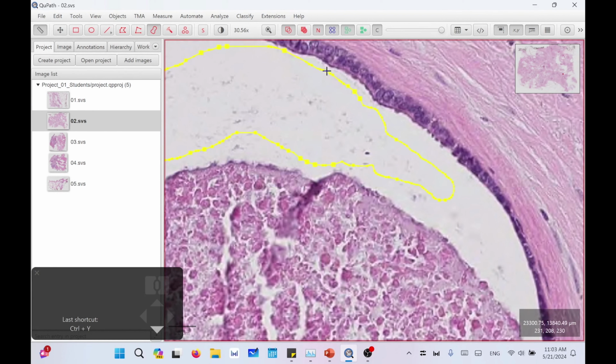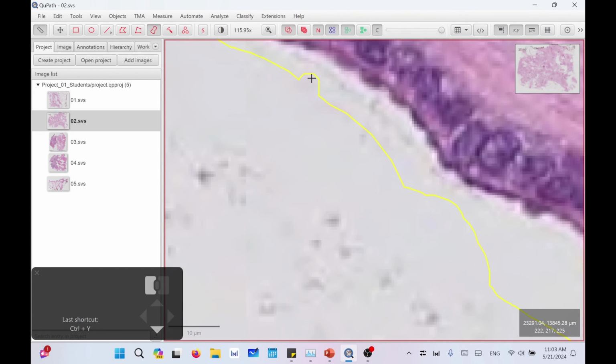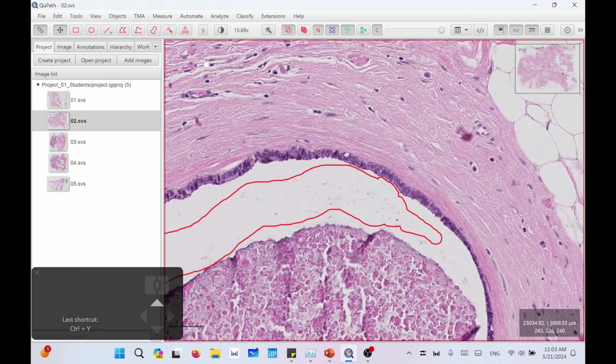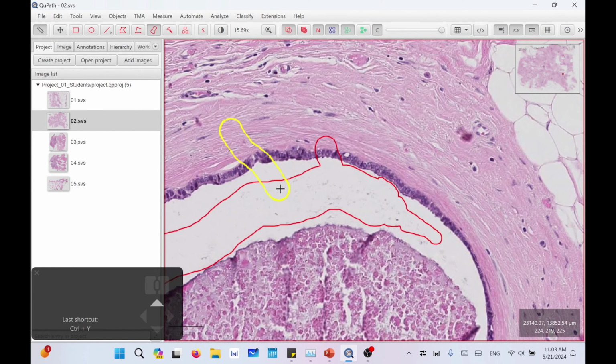Assume you need to refine or find the detail here, you can zoom in, and also from inside you can start to include that region. But if you didn't select it and selected the brush tool from inside to outside, it can also include the region you have annotated. But don't do that from outside to inside like that. It will draw another annotation.